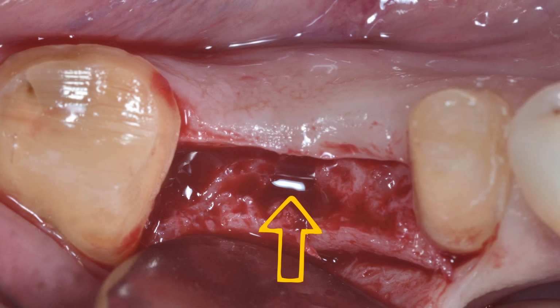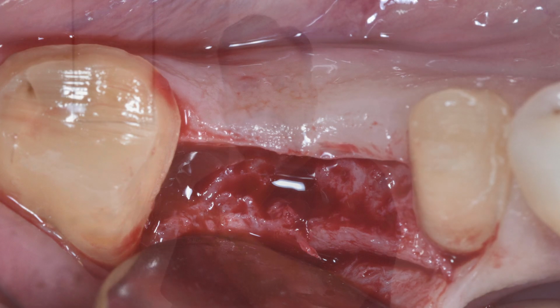I do this before I flap, so that when you flap, you can actually visualize exactly where you nicked that bone. Now, if you're using a more analog protocol, a free-handed surgical protocol, that is even more helpful, because you're going to see that bleeding point through the tissue, and you're also going to see it once you flap the tissue, in the bone. And it's going to be a lot easier for you to continue that initial drilling with the lancet drill and go to the depth that you're trying to accomplish. Either 8, 10, 11.5, 13 millimeters, whatever the length of the implant that you're going to use, that's how deep you're going to go in that initial drilling.